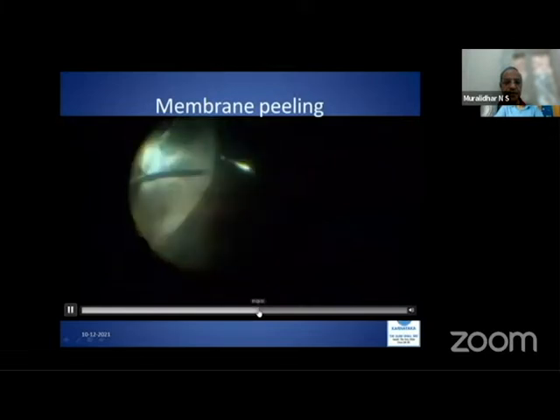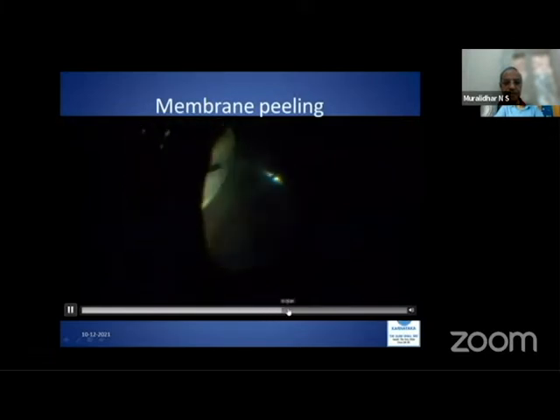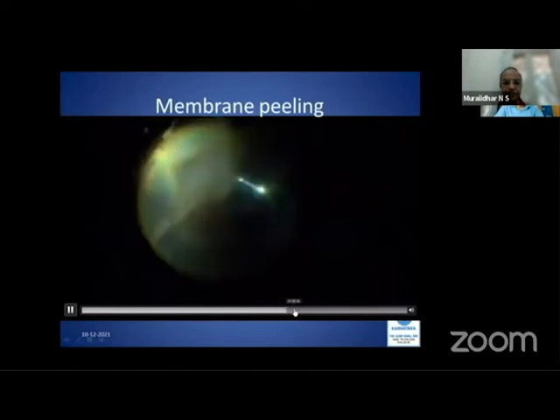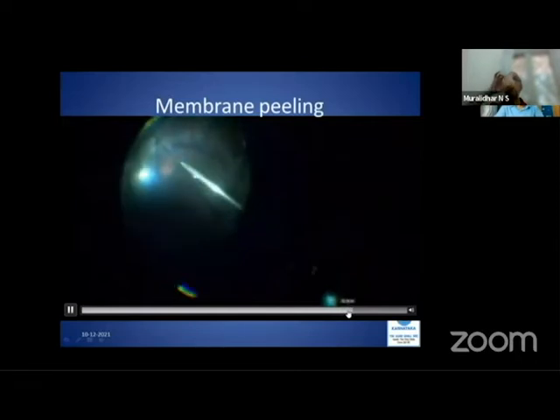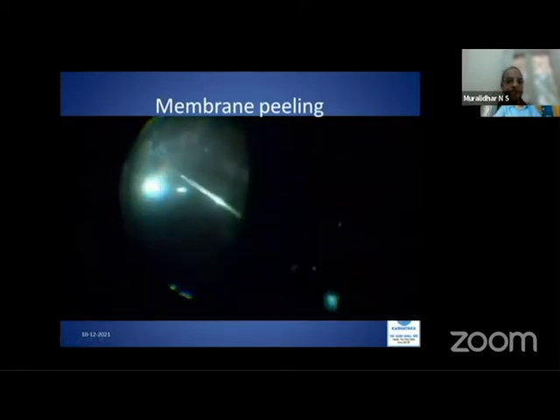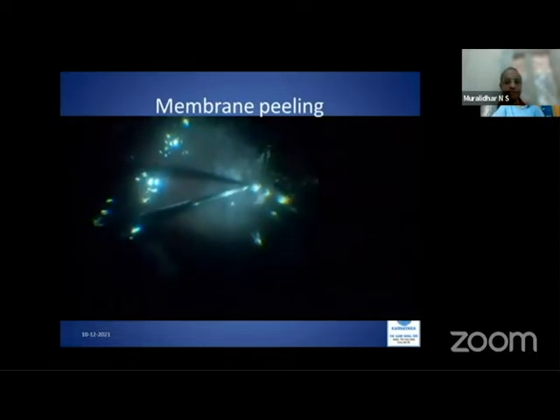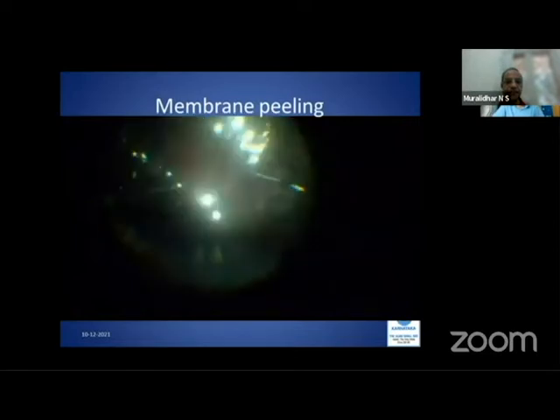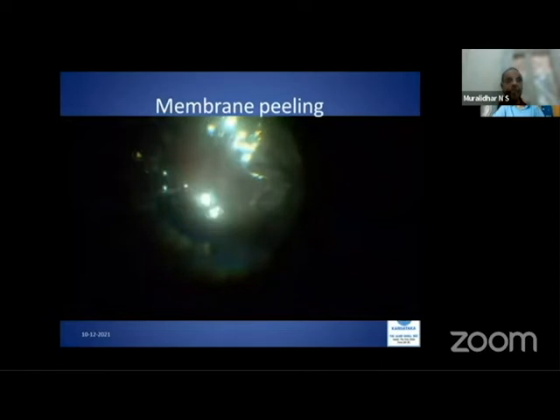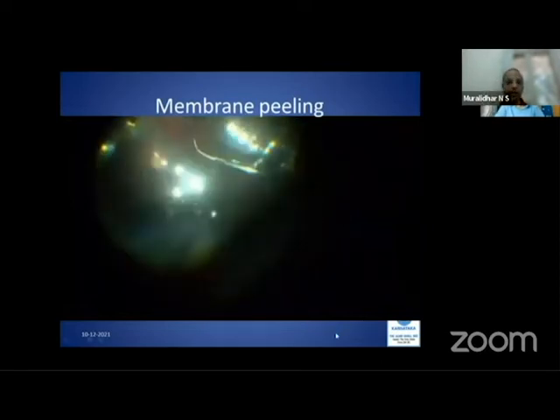Once this membrane peeling is done, if no subretinal band is there, then we can go ahead with the fluid air exchange. Most often we can use a pre-existing break. It's not necessary to create a retinotomy in these eyes because we would have created some break somewhere. So drain from the most posterior break, and if the retina settles down nicely and flattens, that means you have relieved all the traction, and a liberal laser to the breaks and the periphery is done before tamponade.